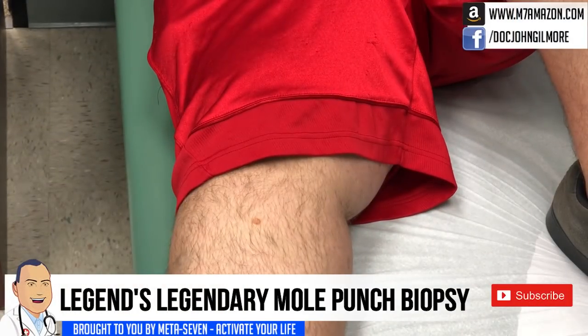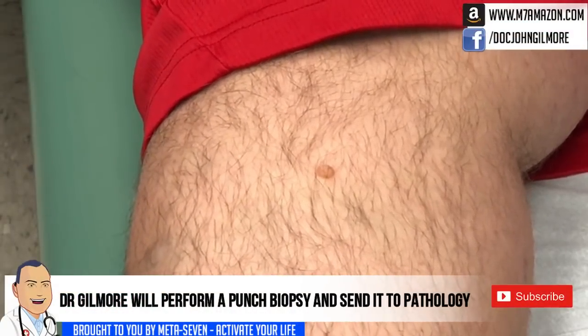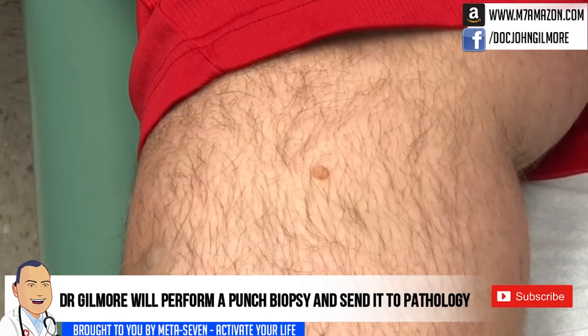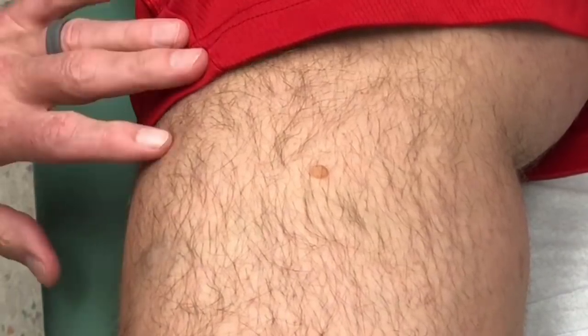We're rolling with our patient Legend. How you doing? Got something on your right leg — how long have you had it? Probably about six or seven years. Has it ever changed? No, it's been slowly getting bigger. I think it's small enough we can use a punch biopsy, just remove it, put a stitch in and be done. We'll send it to the pathologist to make sure it's not anything important. It just looks like a little mole, should be just fine. You okay if we video this for our friends on YouTube? Awesome, thank you.